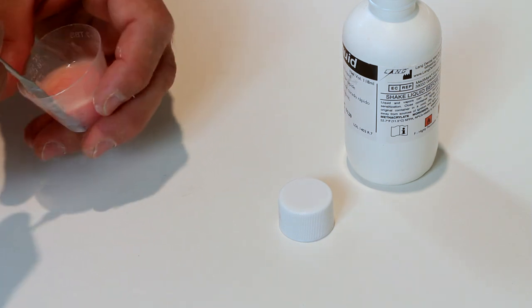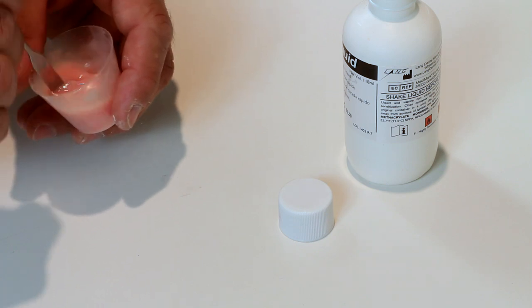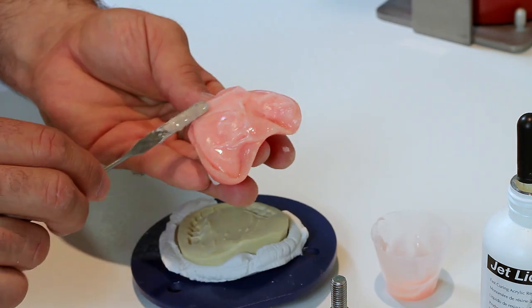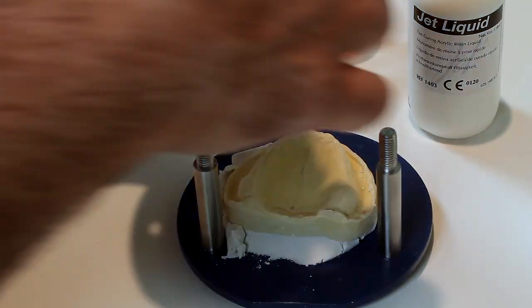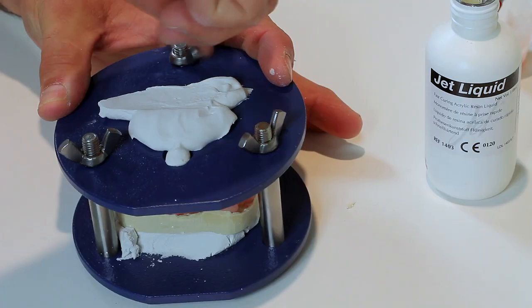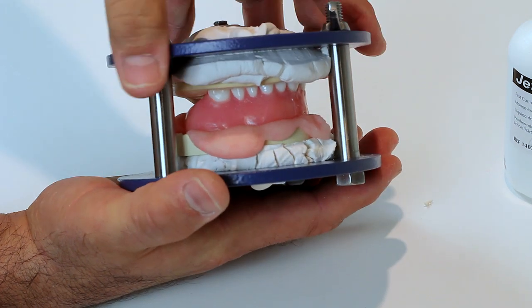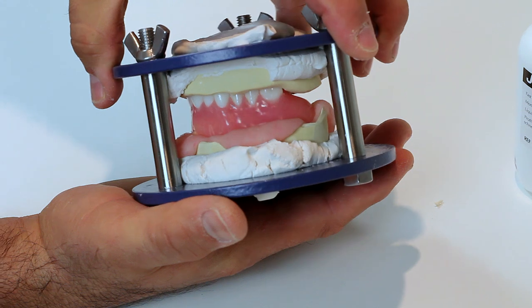Mix Lange's Jet Denture Repair Acrylic. Per jet acrylic instructions on set time, place the mixed repair acrylic into the denture throughout the arch form. Then, place the upper member of the jig and refasten the wing nuts all the way down. Be certain that flash appears all the way around the denture to cover all areas.